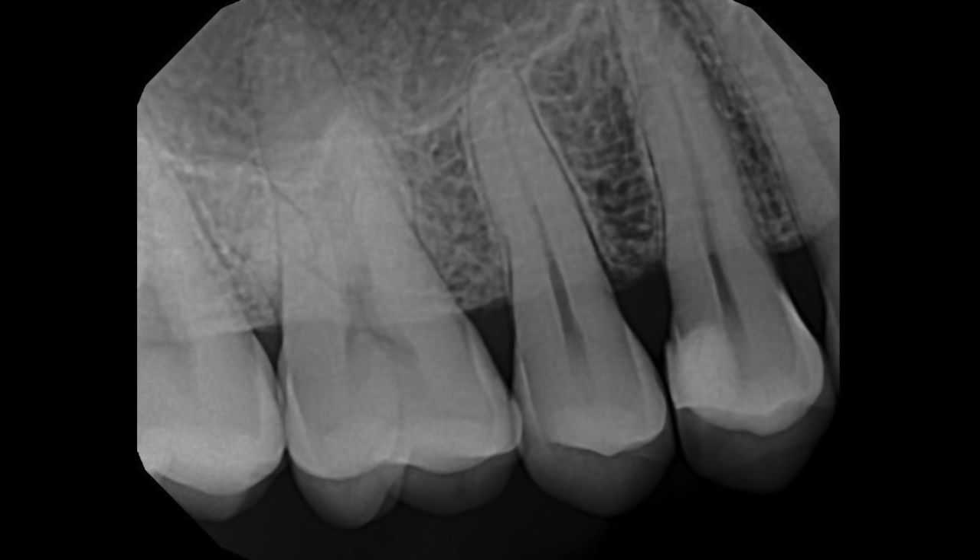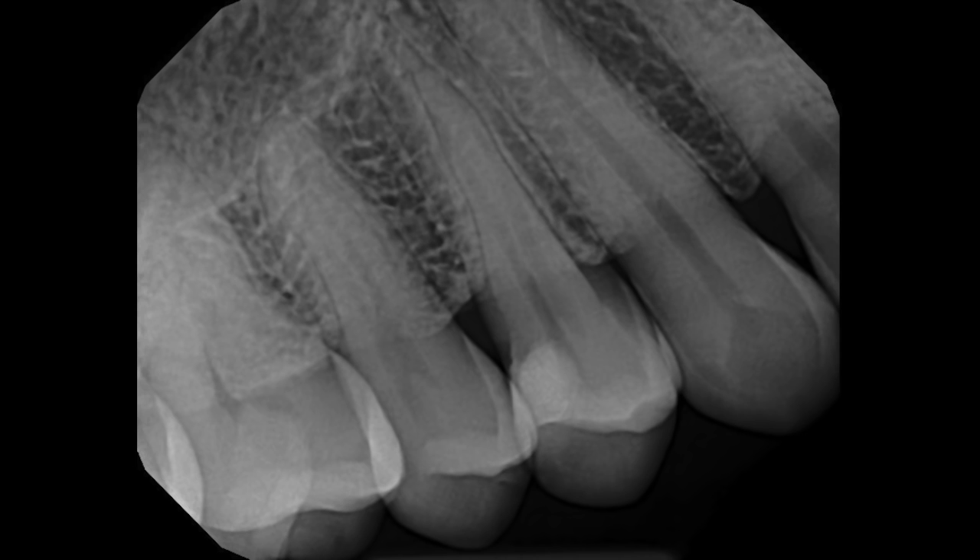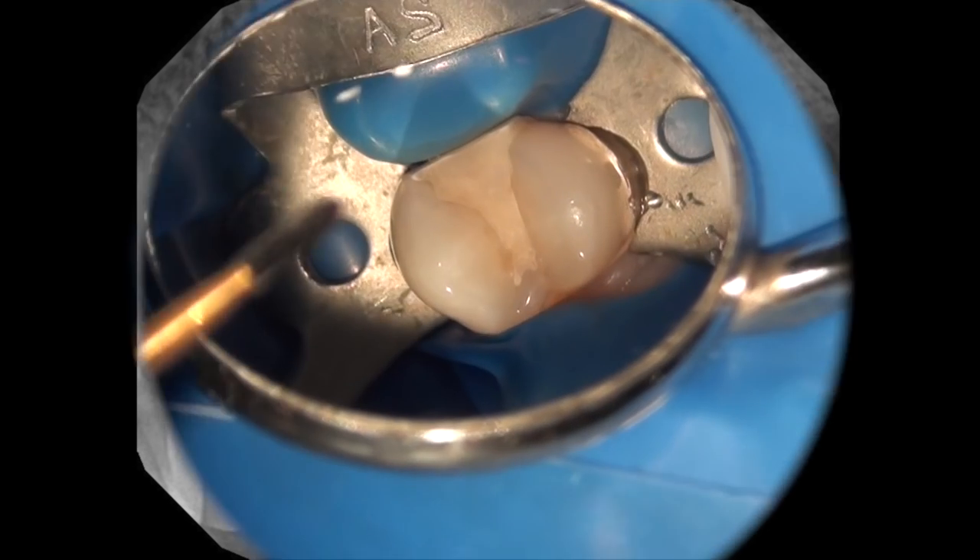As you can see here on this radiograph, this tooth has a fairly large restoration on the mesial that has caused irreversible pulpitis. And as you can see on this angle radiograph, you have two roots in this tooth, as is the case in almost all maxillary first premolars. As usual, we always start by taking a look at root anatomy and also make an estimate of working length of the roots, and here it looks like it's going to be 24 millimeters.